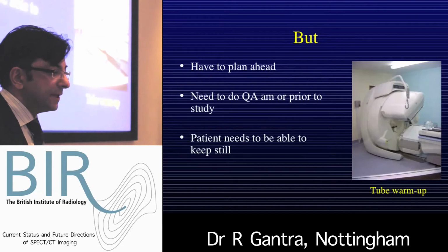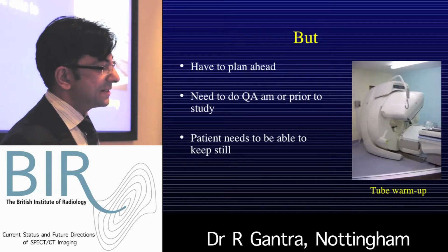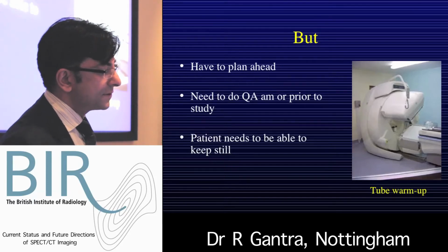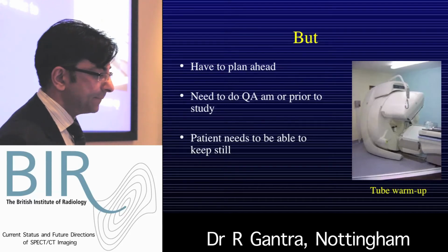There are issues with these machines. You do have to plan ahead before the patient arrives to decide that you might do a SPECT CT that day, and that's because a variety of QA is involved. And also, there is the additional time, so you've got to schedule your patients accordingly.